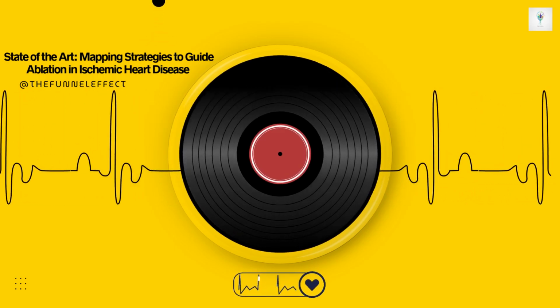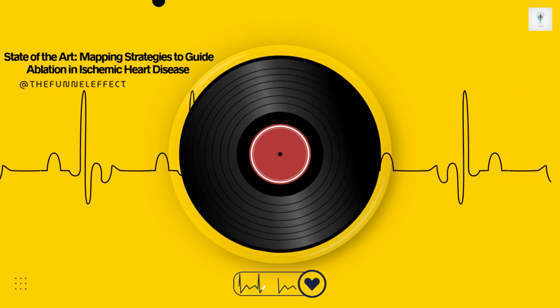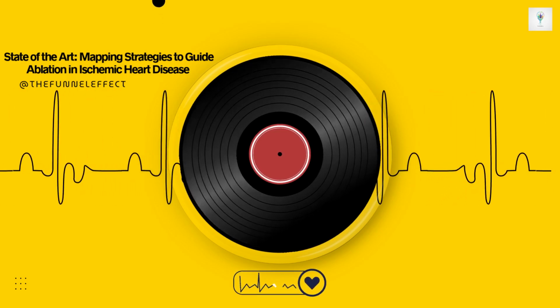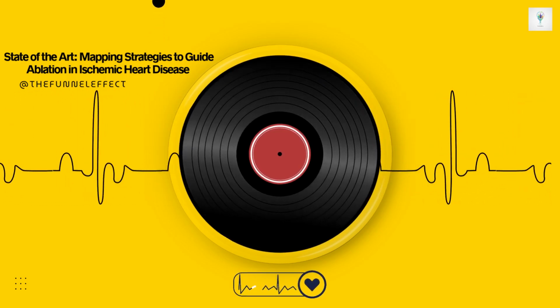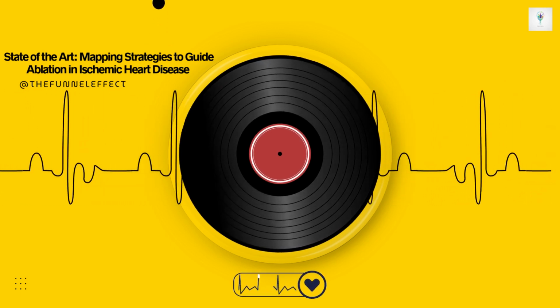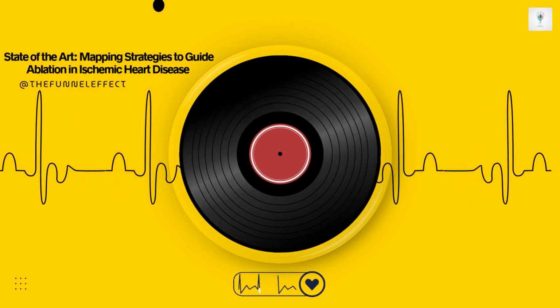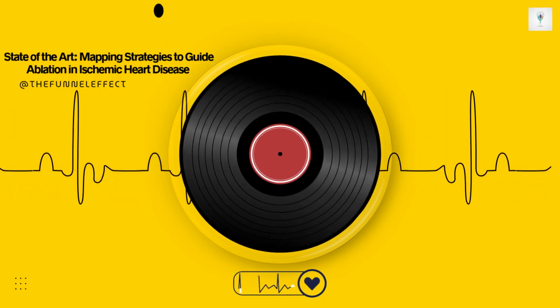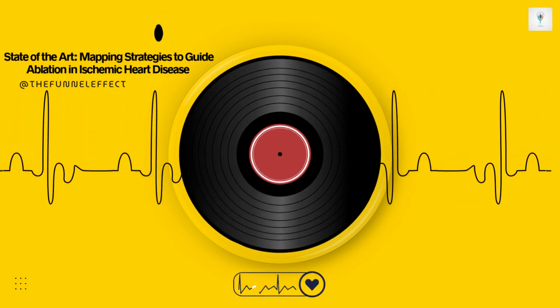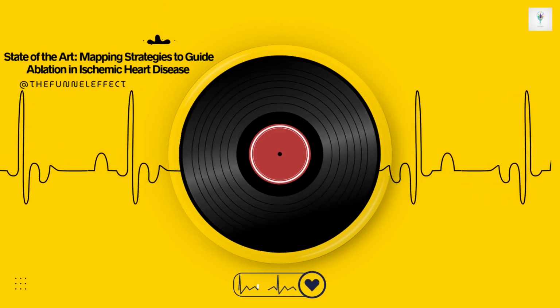But the authors really emphasize how varied these scars are. They're not all the same shape or structure. Oh, not at all. These circuits are seriously complex, three-dimensional things. An isthmus could be tiny, short and wide. Or it could be centimeters long but less than a millimeter across. And location-wise, it could be right on the inner surface, the endocardium. It could be deep inside the heart wall, intramural. Or even on the outer surface, the epicardium. This variability is exactly why we need a whole toolkit of mapping strategies. One size definitely does not fit all.